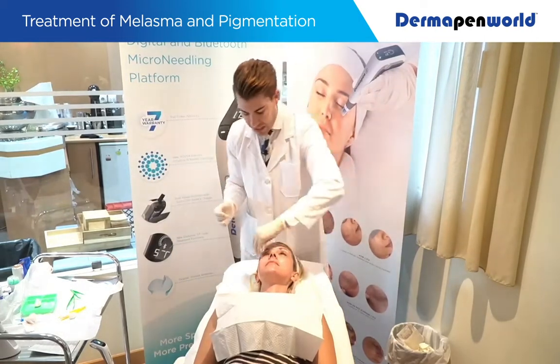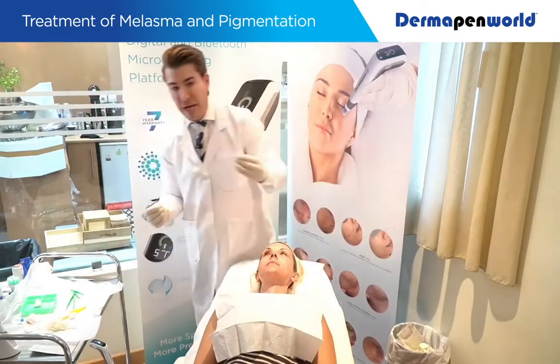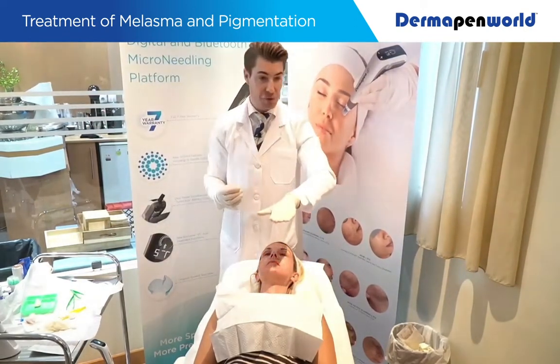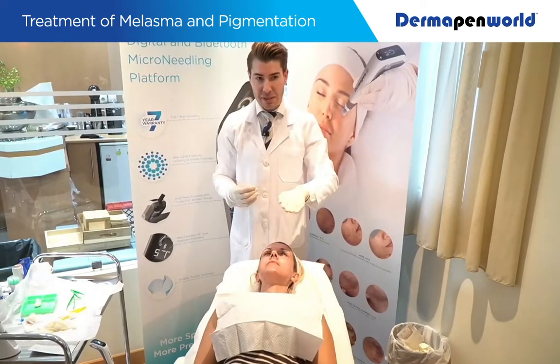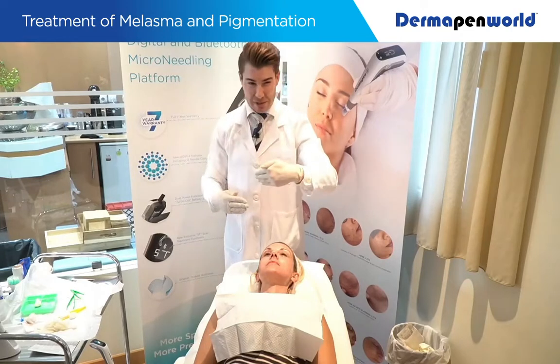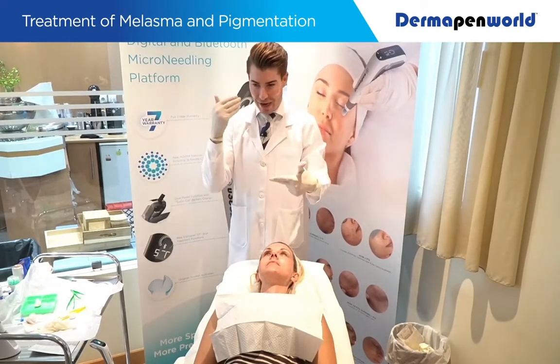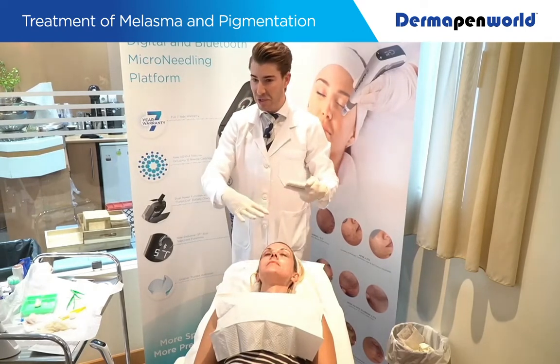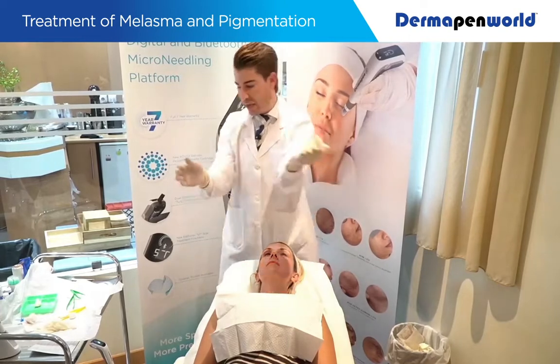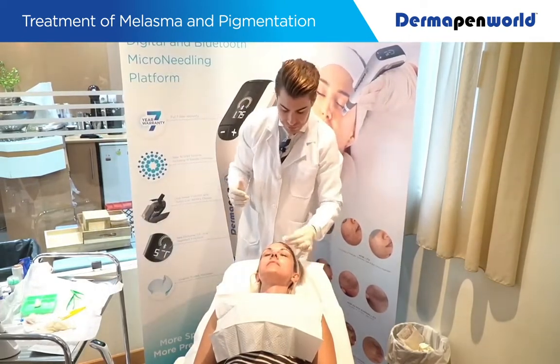Also, because the peel is a pH of 2.05, the peel is self-neutralizing, but the mask speeds it up. Particularly if a patient has undergone traditional TCA or Jessner peels and they can't sweat, they can't cry, they can't get rained on, they have to be so careful. With this, it signifies to the patient nothing can reactivate following the procedure. So, I just absorb any excess residue.